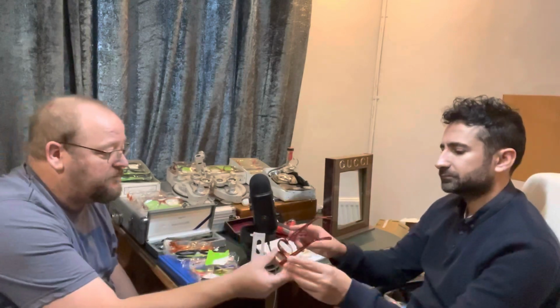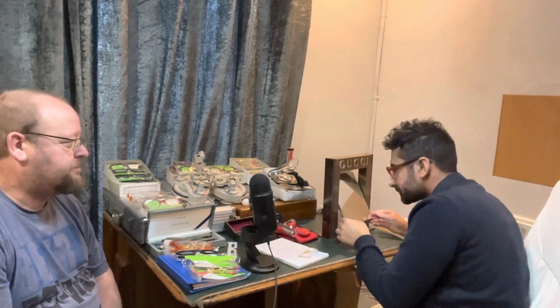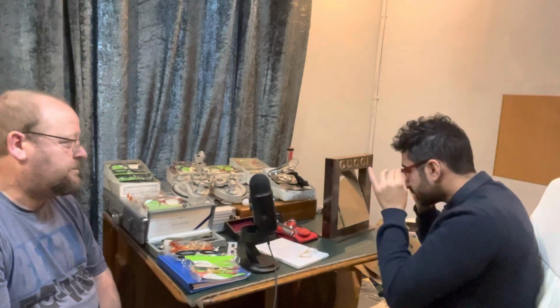You want to try them on for me? First thing I notice is they're a little bit more weighty than the Shirley. Yes, Shirley, sorry. It's definitely a better fit behind your ears than the Shirley. Do you want to use the lens to help you look?